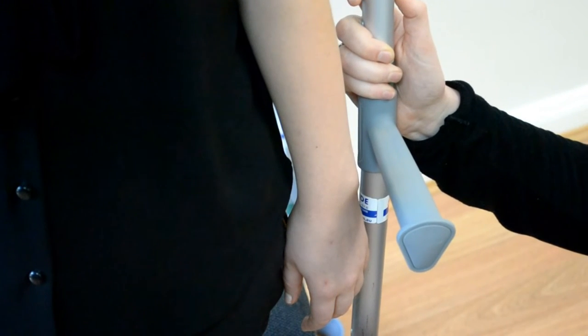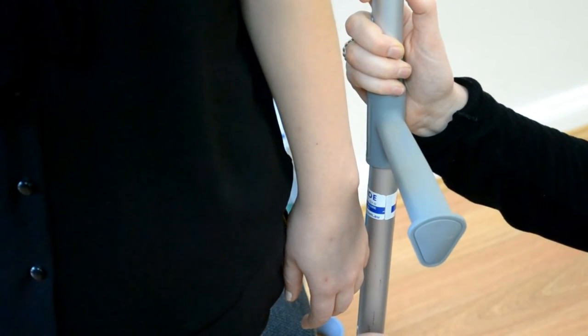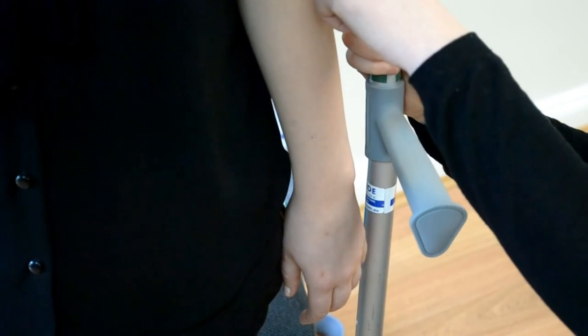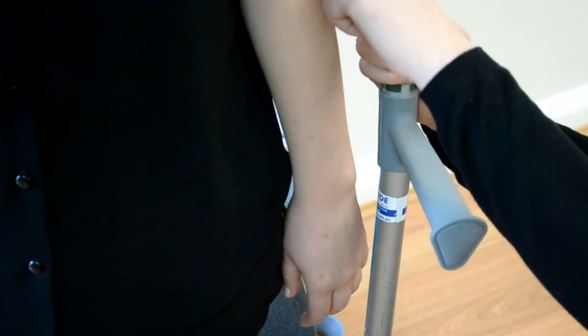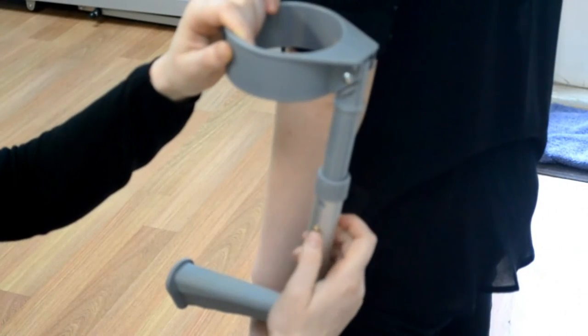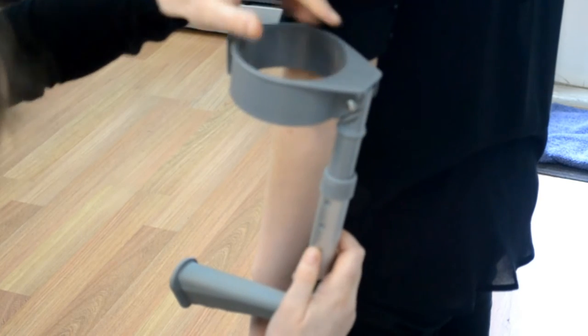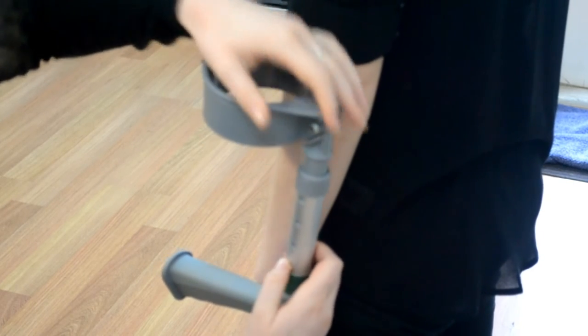The second part is now dropping down the elbow. I want this part down below the elbow crease so that Alex's elbow can actually bend. I'm going to press that down one — still too high — and two. Perfect.